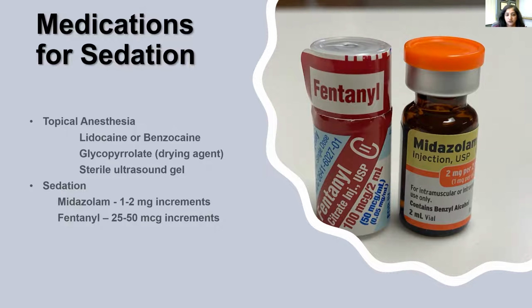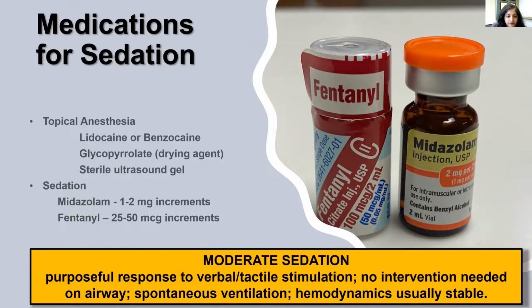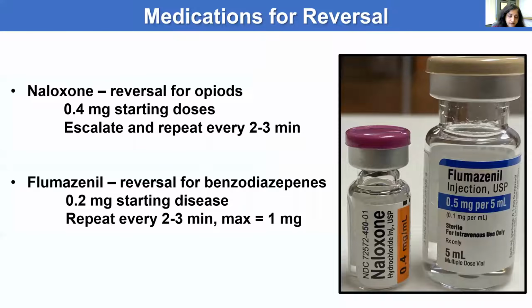Given together in small dose increments at appropriate intervals and titrated to sedation. Remember, the goal of TEE is moderate sedation. So the patient should be sleepy, but responsive to verbal or tactile stimulation. While there may be oxygen that is required, really no intervention is needed on the airway. The patient is still breathing on their own and their hemodynamics are usually stable.